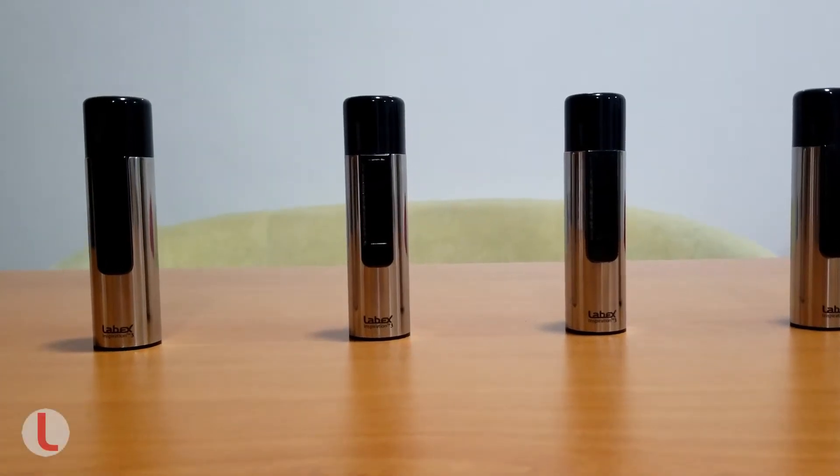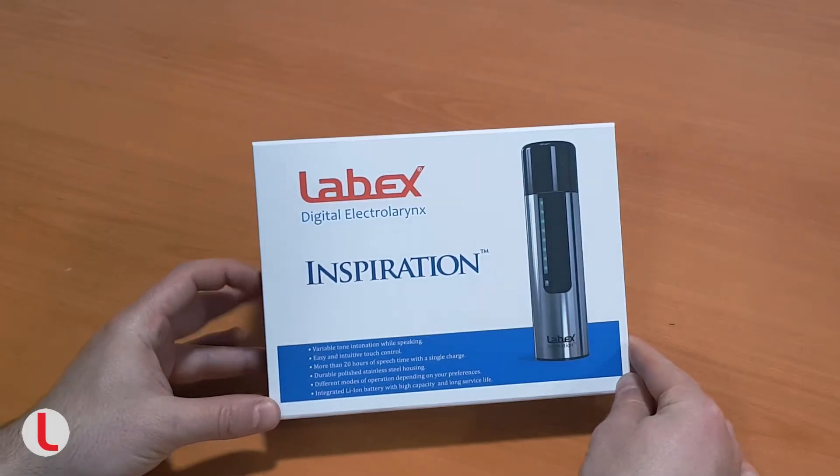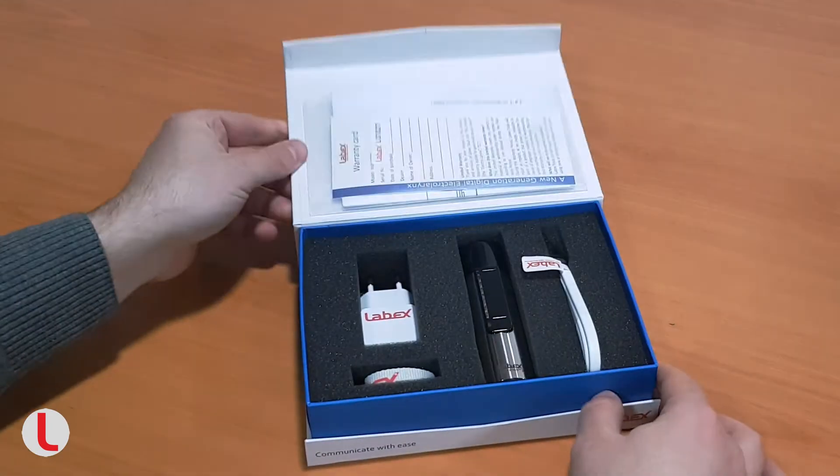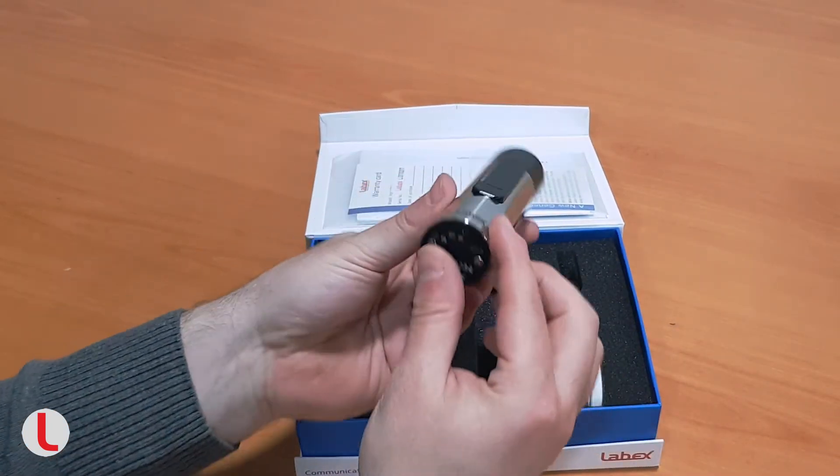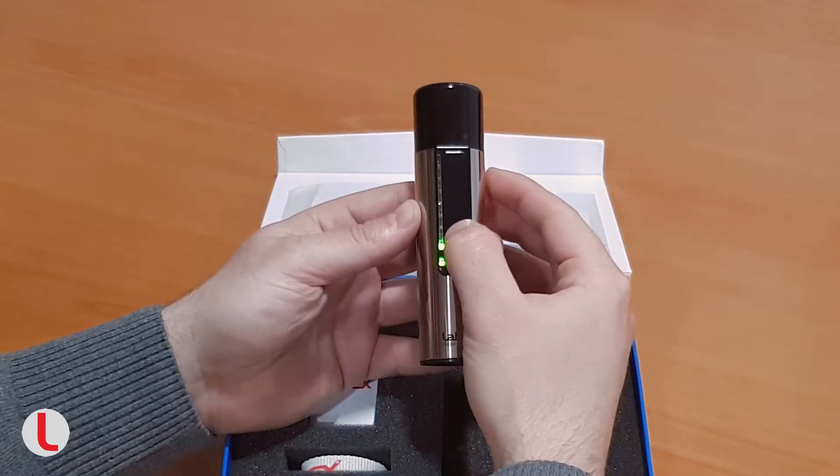Lubex Inspiration. The Inspiration is the most advanced electro larynx on the market. It gives the opportunity to express your emotions while speaking by changing the tone or volume of the sound.